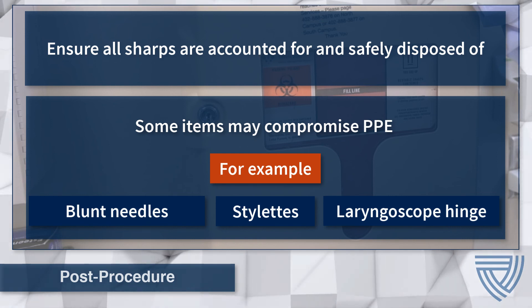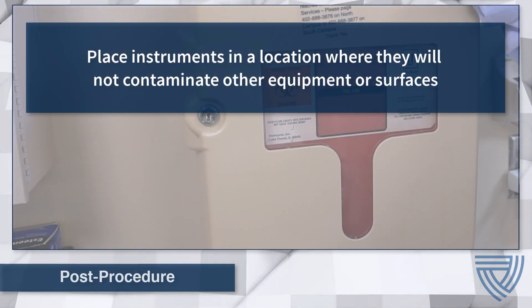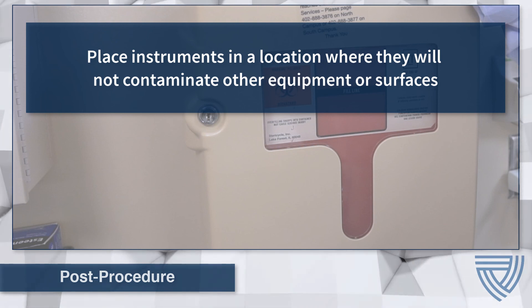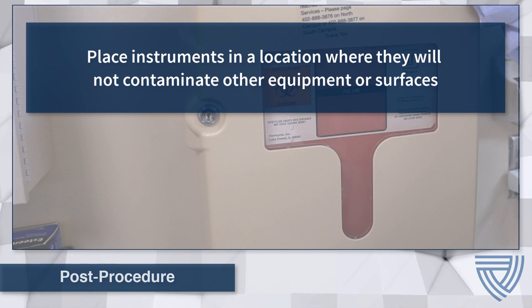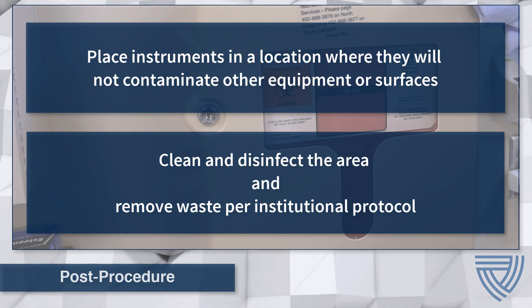Be mindful not to pinch or compromise PPE when manipulating the hinge on an adjustable laryngoscope. Place all instruments in a location where they will not contaminate other equipment or surfaces. Reusable instruments will need to be decontaminated if being sent to sterile processing. Clean and disinfect the area. Remove and dispose of waste per institutional protocol.